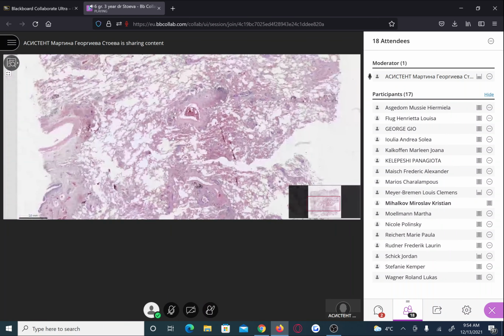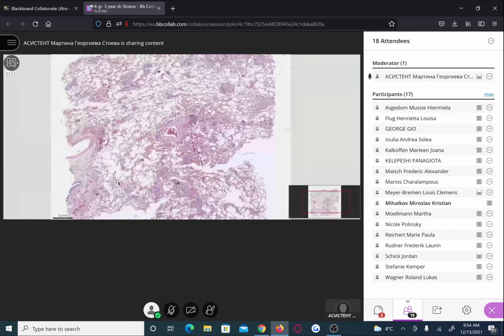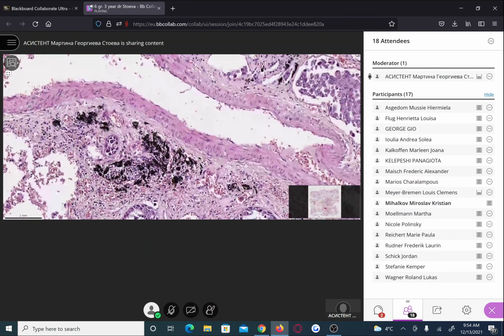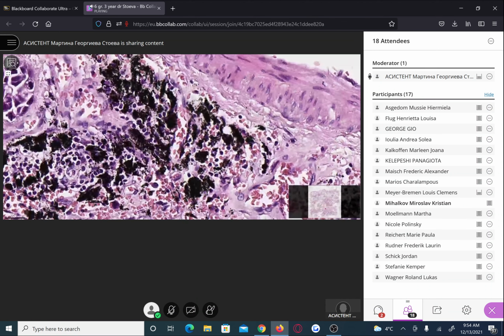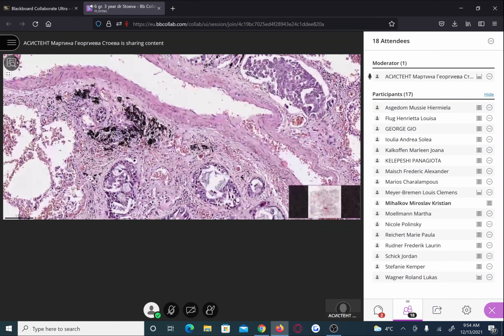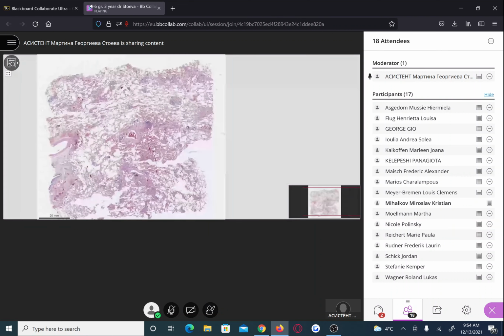And then, at low magnification, we can detect some dark areas. You know that this is anthracotic pigment in the interstitium. These are the coniophages. So all of these structures help us say that the specimen is from the lung. But then, even at low magnification, it's quite obvious that there are some darker zones. These darker zones are exactly the vessels which are filled with tumor cells.